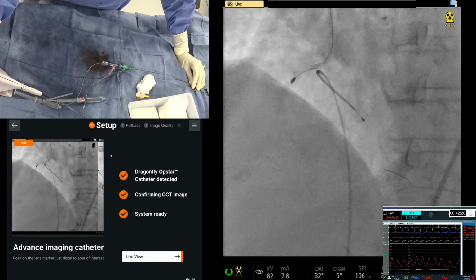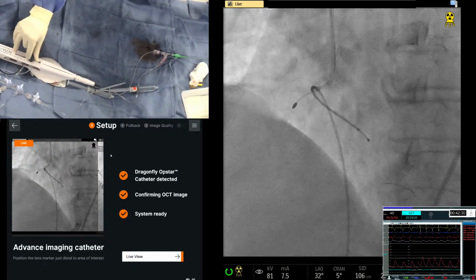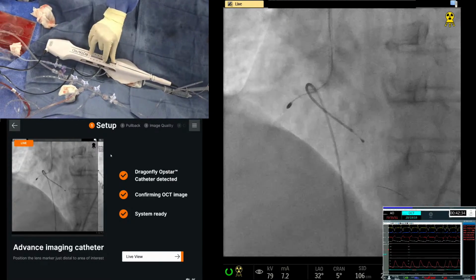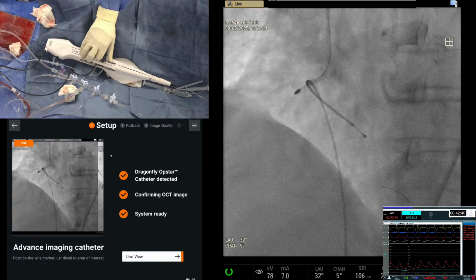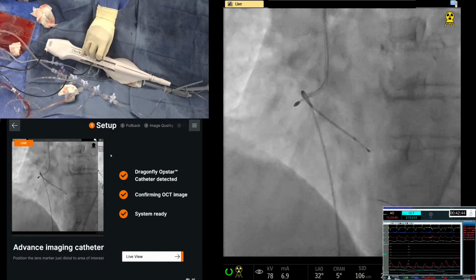You see a little slow heart rate there, yeah? Yeah. Elderly lady, RCA, severe disease, you definitely need it. So now what will happen is, I have to do what is called a movement of the burr with the Dynaglide. You want to give something?